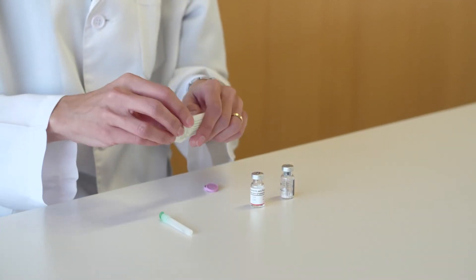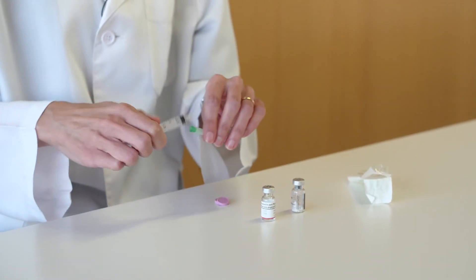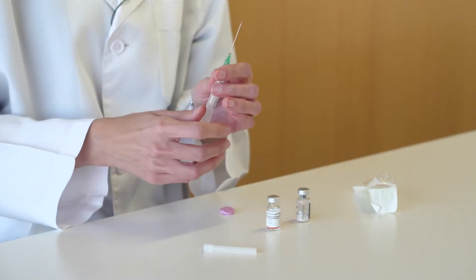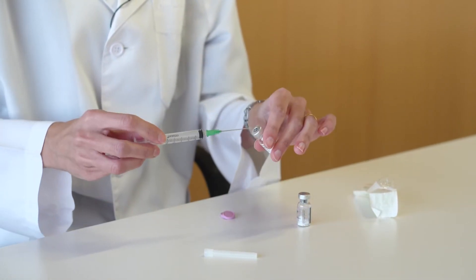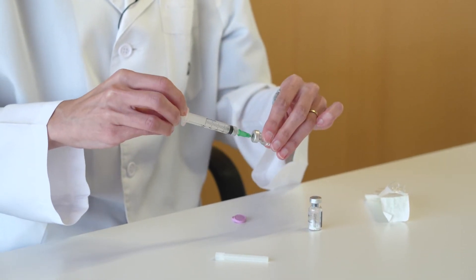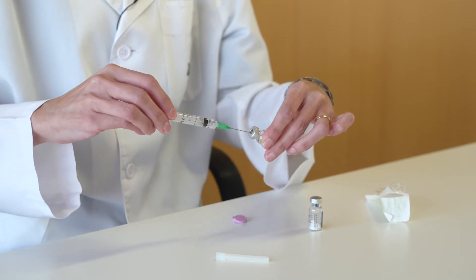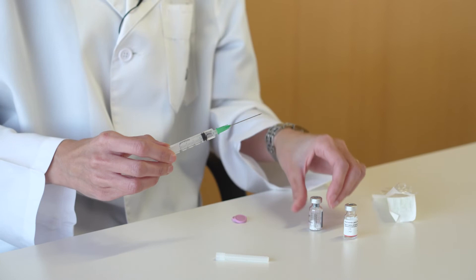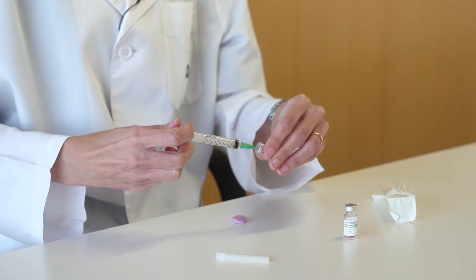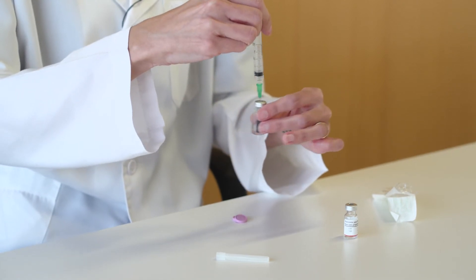Place the large needle into the syringe with the solvent. Introduce the solvent into the vial with the lyophilized powder, mixing gently until the mixture is homogeneous.